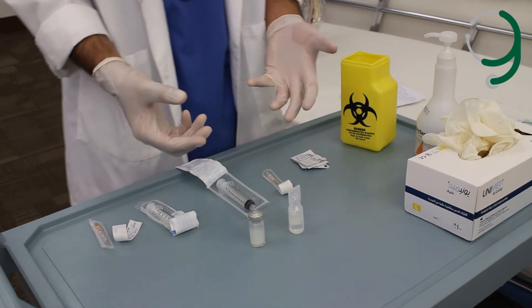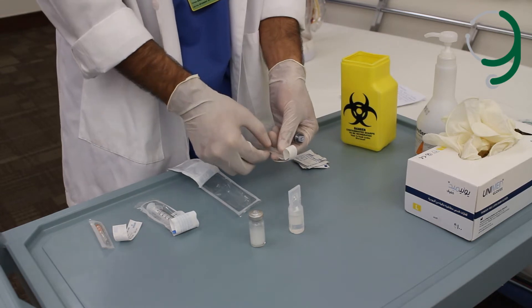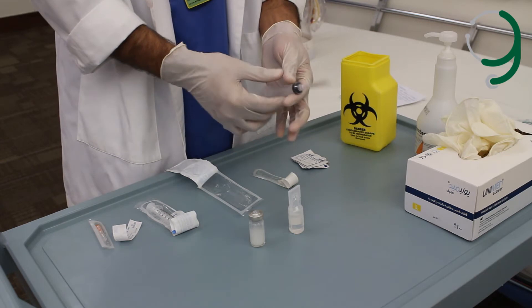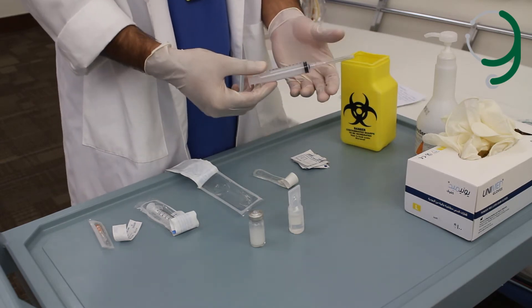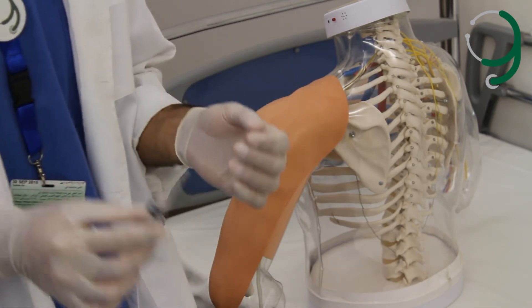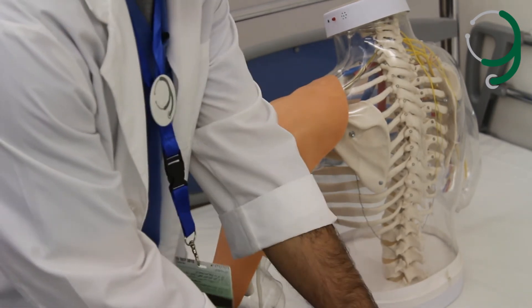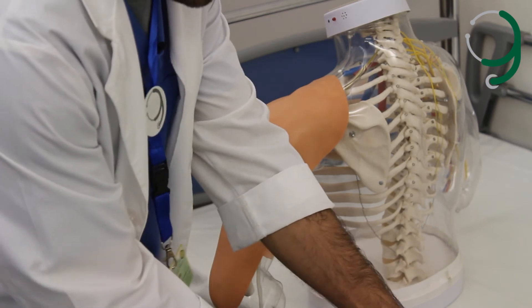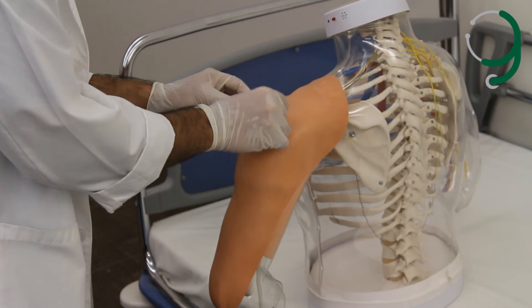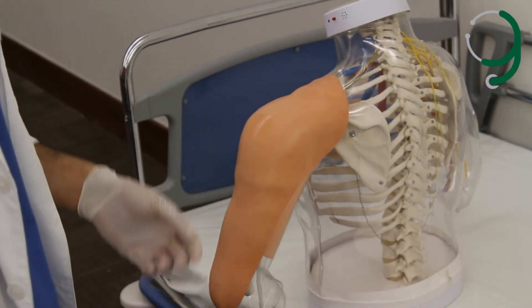We'll begin with the intramuscular injection. We first attach the 23-gauge needle to the syringe, and then we go to determine the site. After we attach the needle, we make sure that the area is clean and wipe it with the alcohol swab three times in a circular motion.